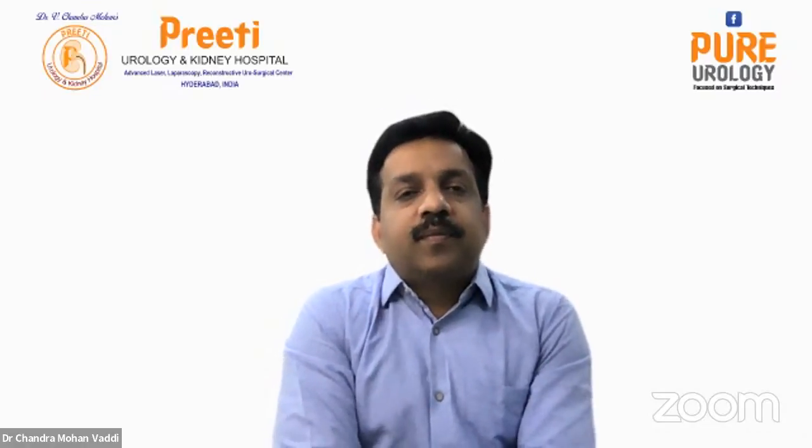270 audience members have joined today. They are listening. So your comment for the juniors: when the ureter is tight, what will you do in your theater? Maybe 1 or 2 weeks ago, I performed such a case. My junior staff tried, but it was very tight, a ureteral stricture. He failed the retrograde surgery, so he passed the patient to me. I pre-stented for 2 weeks, and then I performed intrarenal surgery, combined with PCNL in that case. Good, that's a great message.